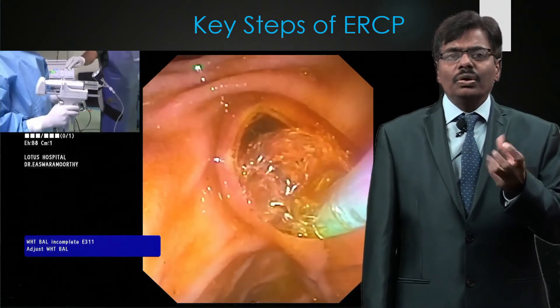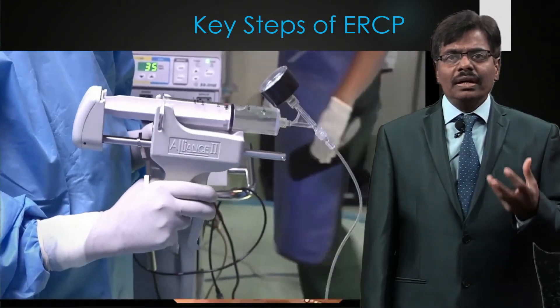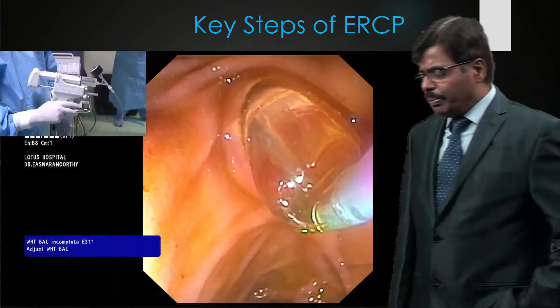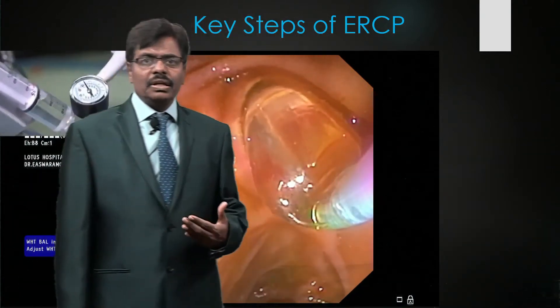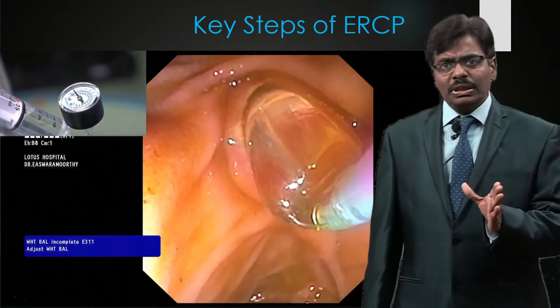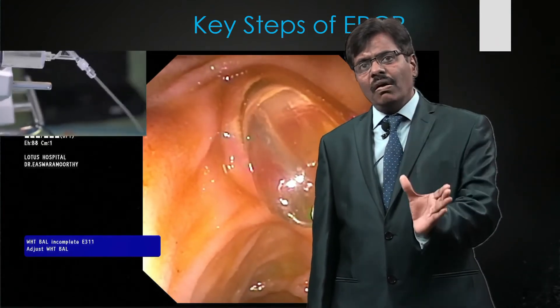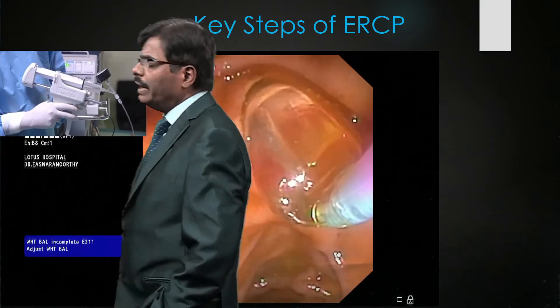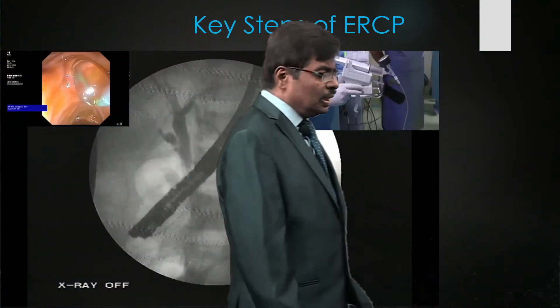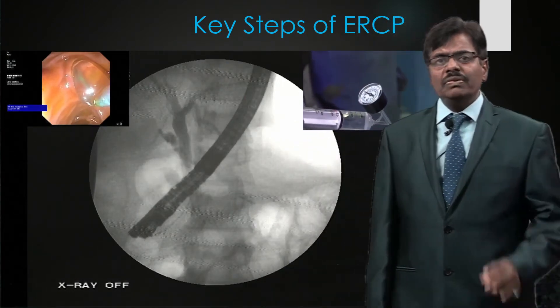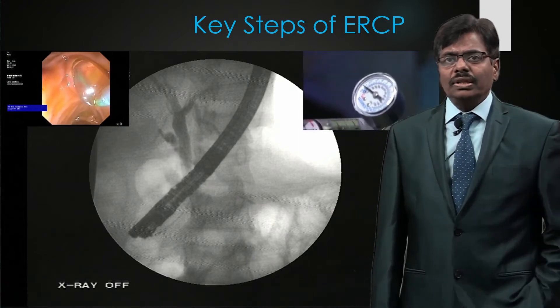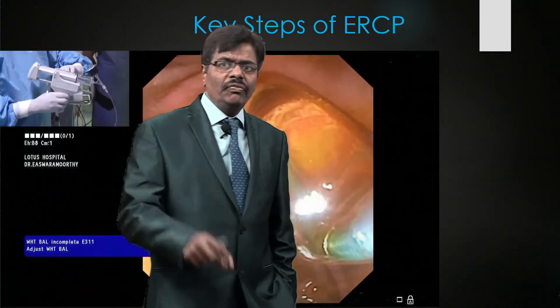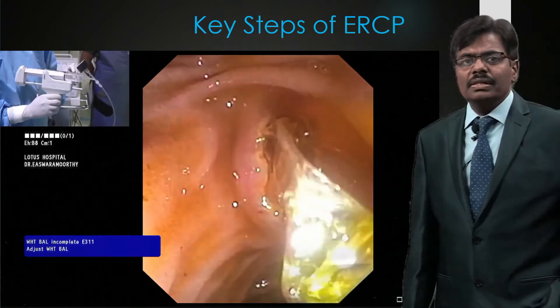Watch my staff nurse's hand — like holding a pistol. The balloon is inflated with saline, creating a gradual controlled radial and circumferential expansion. Those who say this increases post-ERCP pancreatitis risk should note that once a sphincterotomy is done, the resistance is already relieved — so there is no increased incidence of pancreatitis in my opinion. Leave it for about one minute to achieve hemostasis. The nurse reads the gauge to tell me the atmospheric pressure, confirming approximately 10 mm size.